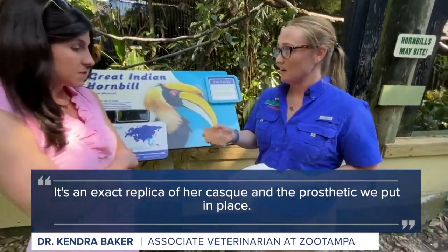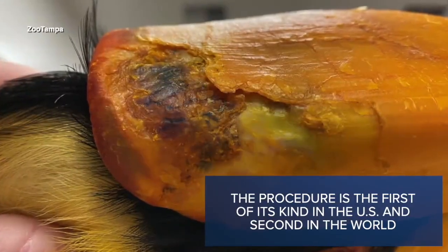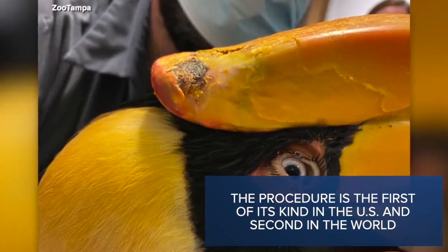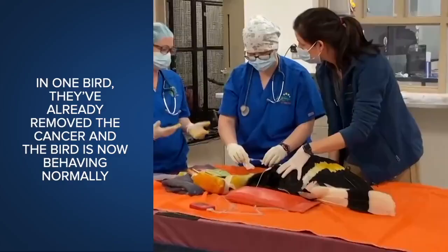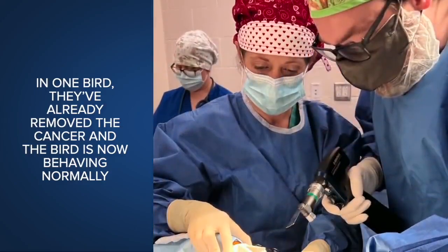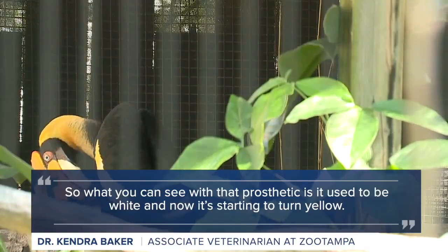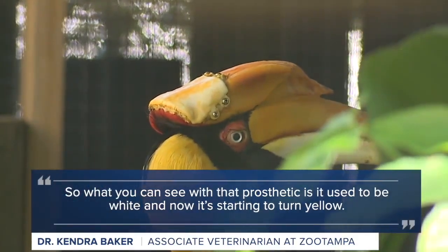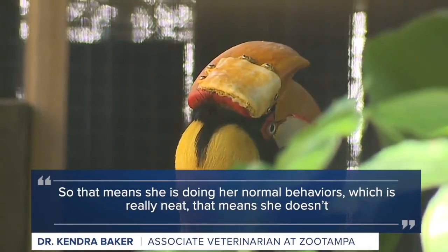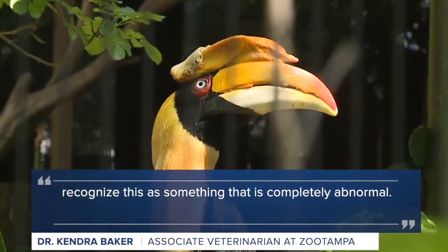This is an exact replica of her casque and the prosthetic that we put in place. What you can see with that prosthetic is it used to be white and now it's starting to turn yellow. That means that she is doing her normal behaviors, which is really neat. It means that she doesn't recognize this as something that is completely abnormal.